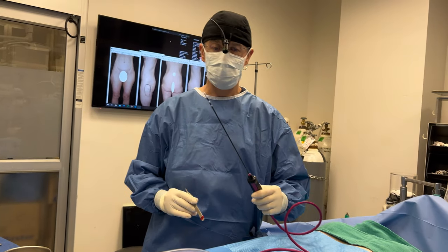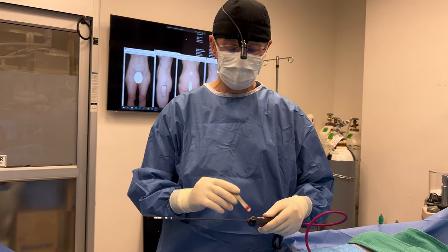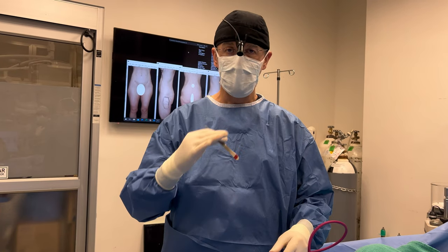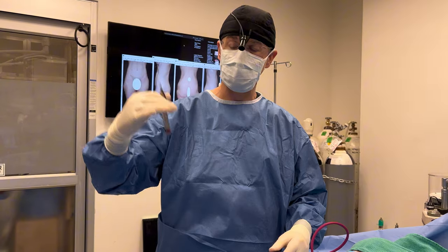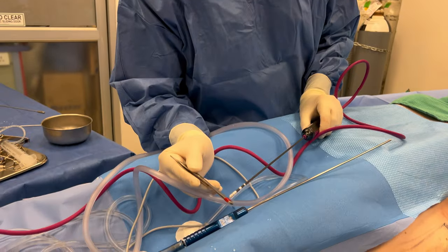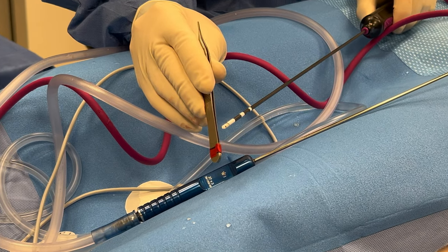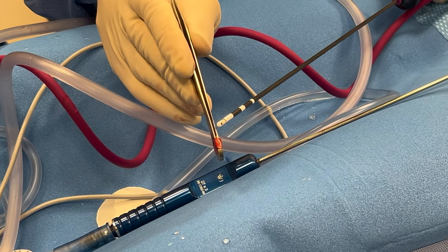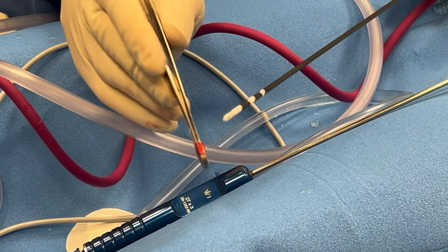After the liposuction, we're going to be using our Renuvion J-plasma tool. This is a tool that delivers helium gas that is then excited by radio frequency, making it go from the gaseous phase to the plasma phase. That's how I create a little spark here — and that little spark is going to create a little tissue contraction.